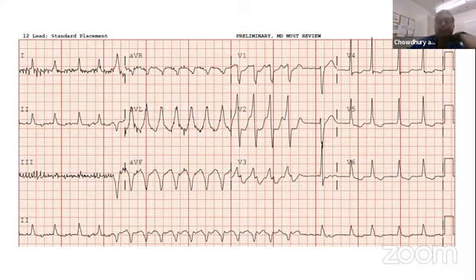Another, Rofik Bhai is here. This patient is on the floor and had an EKG, and they are asking what do you think about the wide complex tachycardia in the middle of the EKG? Two questions: one is the baseline rhythm, and then in the middle, what is happening? If you look at the rhythm strip, lead two, it completely changes axis when it goes into the tachycardia. So we read it as atrial fibrillation baseline and non-sustained VT. And they're asking what we do next.